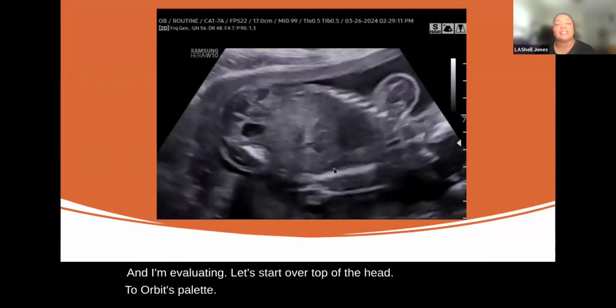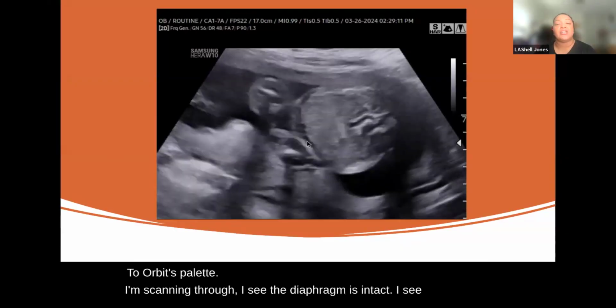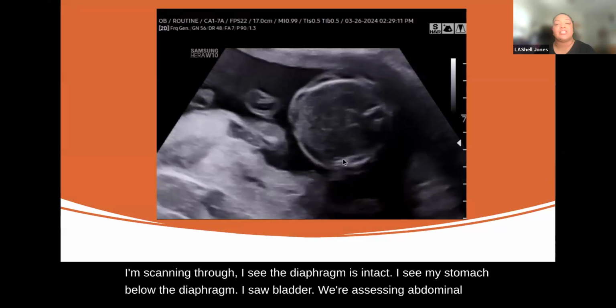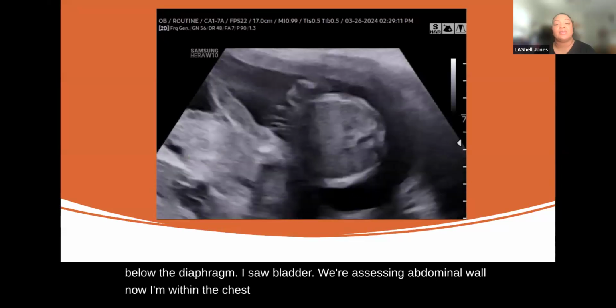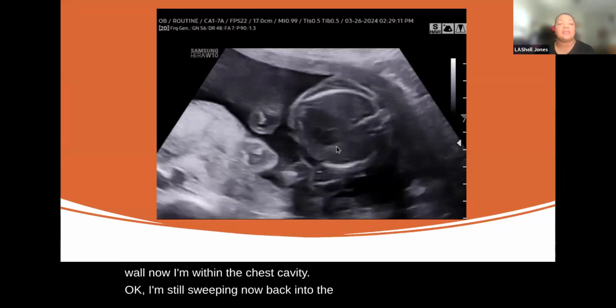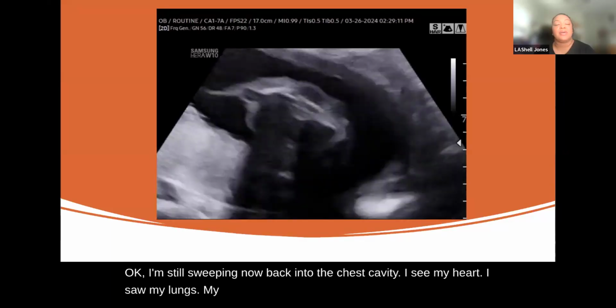I'm scanning through. I see the diaphragm is intact. I see my stomach below the diaphragm. I saw bladder. We're assessing the abdominal wall. Now I'm within the chest cavity. Okay, I'm still sweeping. Now back into the chest cavity. I see my heart. I saw my lungs, my stomach, my diaphragm.